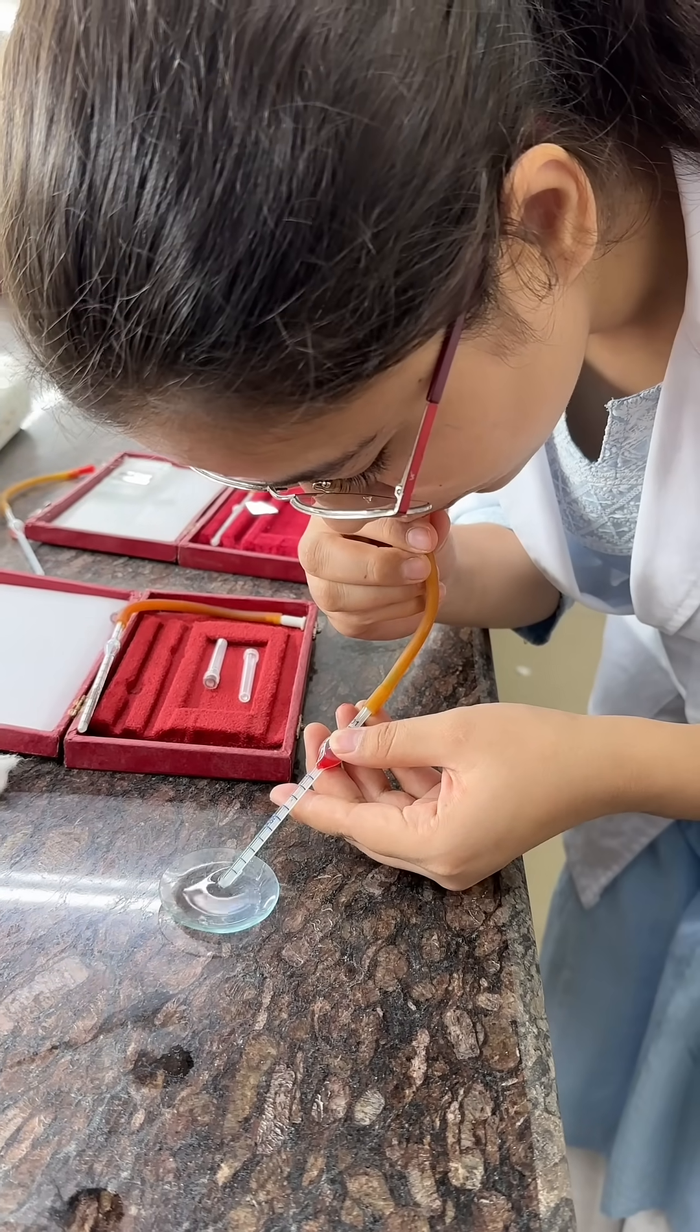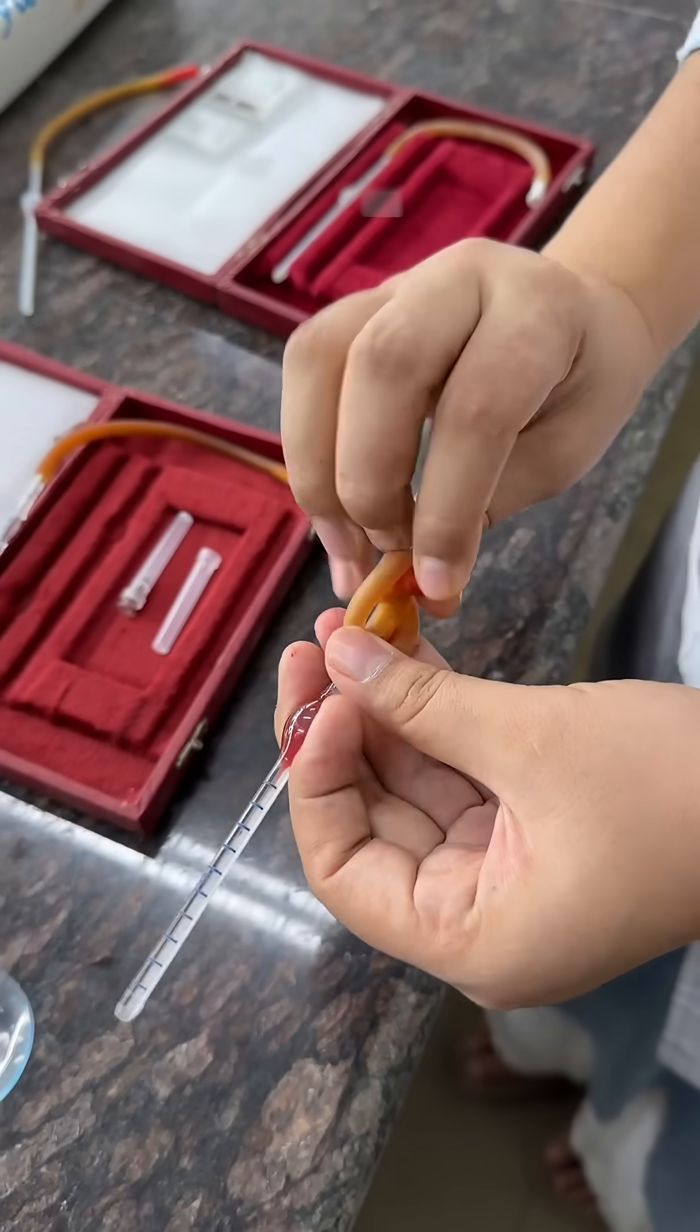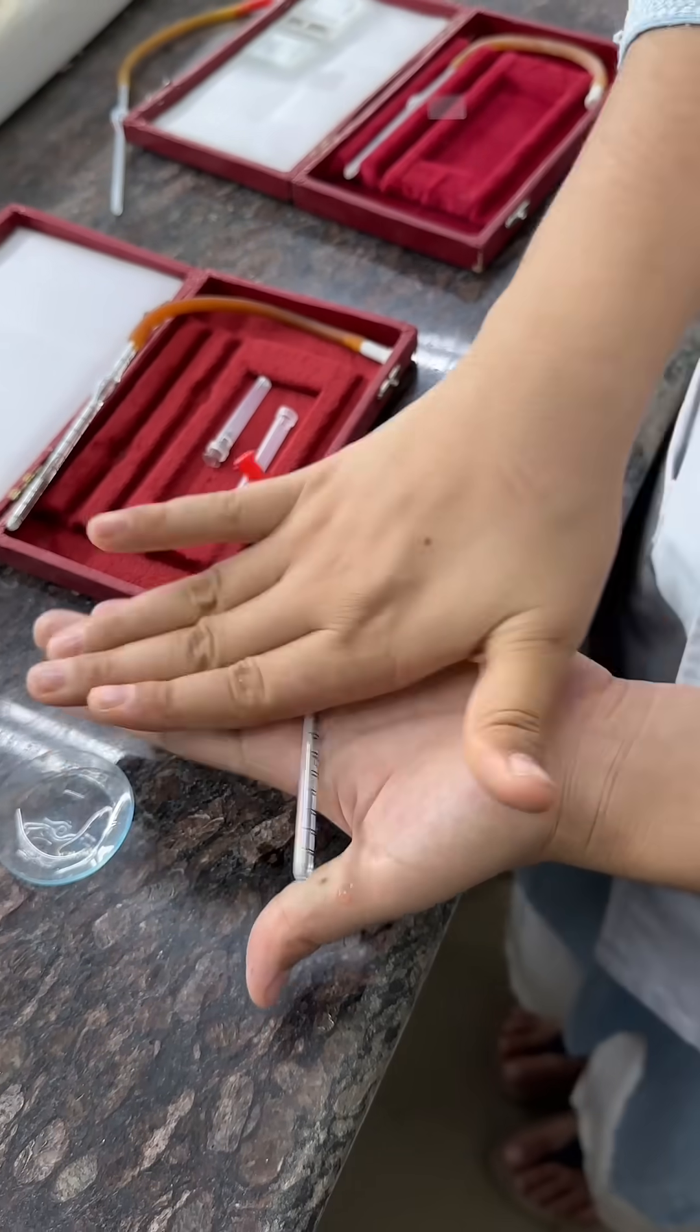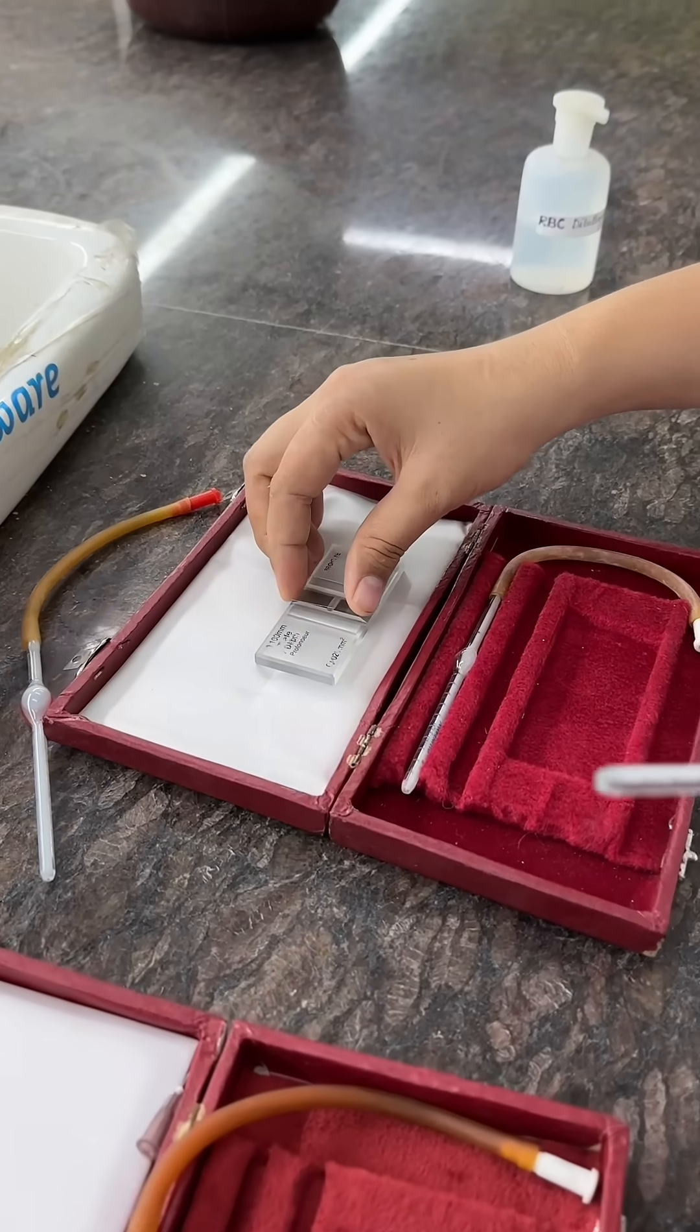Then keep it between palms and roll gently for a minute. Place cover slip over Neubauer's chamber.